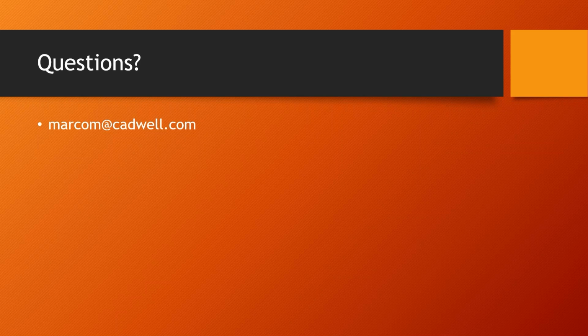But at this point, I just haven't seen a lot of these other trends used with neonates. So if there is anybody out there that is currently using different trends for neonates, I'd very much be interested in hearing about it. So yeah, please let me know. Type it into the chat if it's something that you're currently doing.